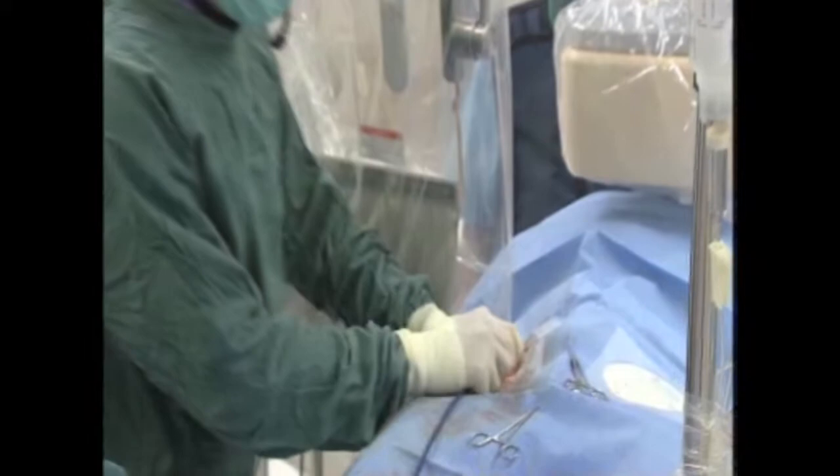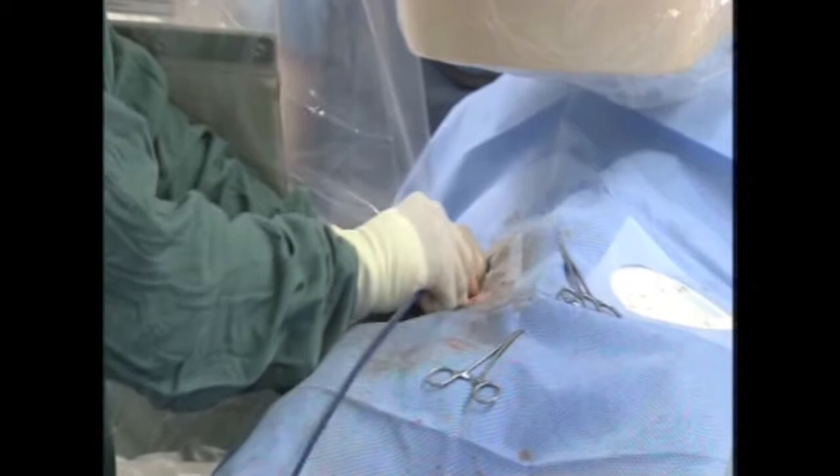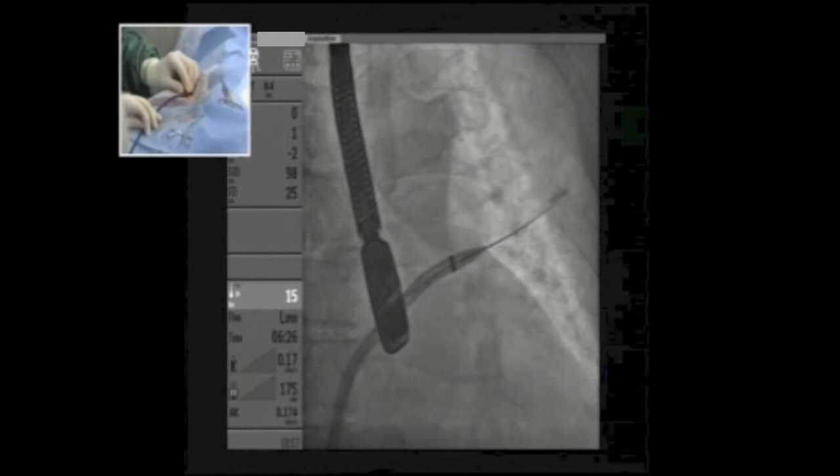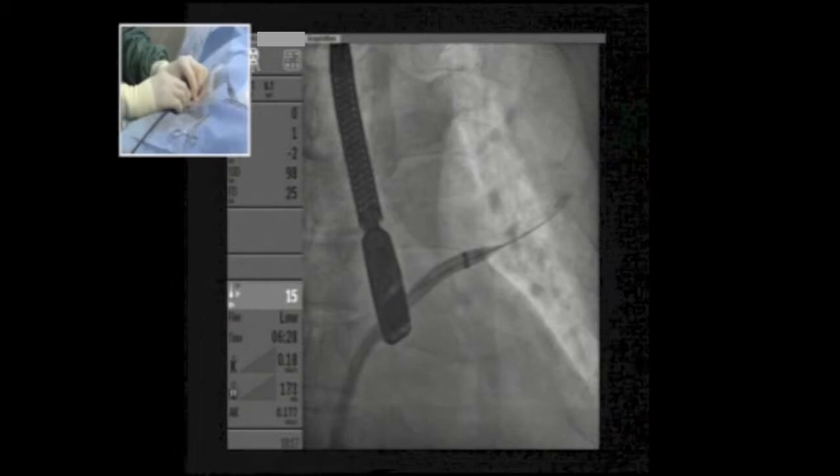We are pre-dilating the groin track to ensure smooth passage. We rotate the sheath to make sure it is coaxial with the wire. The second part through the septum will be more difficult, but since we have the wire in the pulmonary vein the support is better.